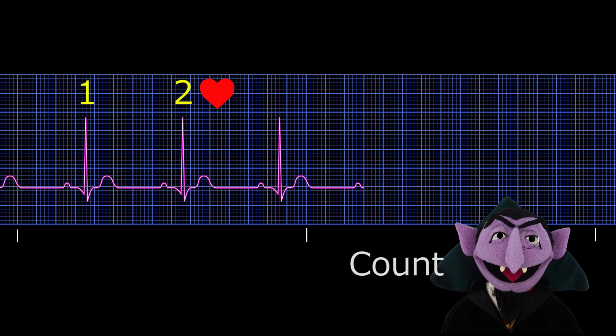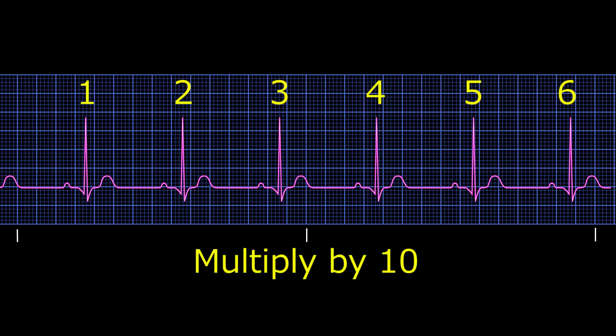After counting the number of beats in six seconds and multiplying that by 10, that number is your heart rate. Let's do one.